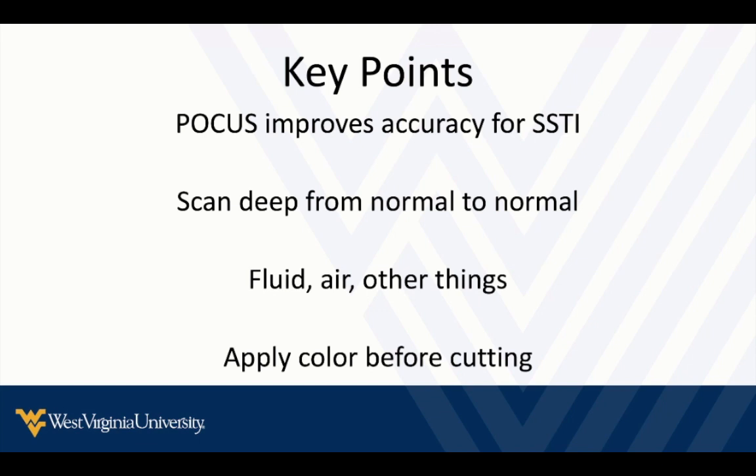Make sure you know what fluid's going to look like, air, and other things that you may encounter. A lot of the fluid is not well circumscribed. It can be complex and loculated. Always apply color before you place a blade into any lesion.